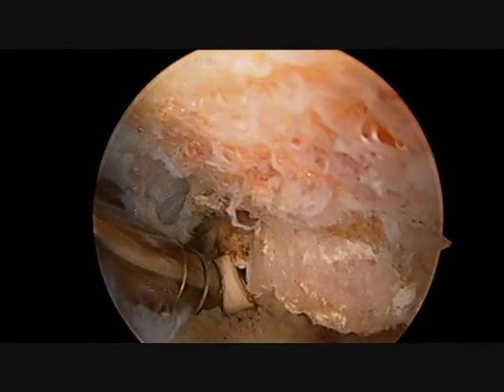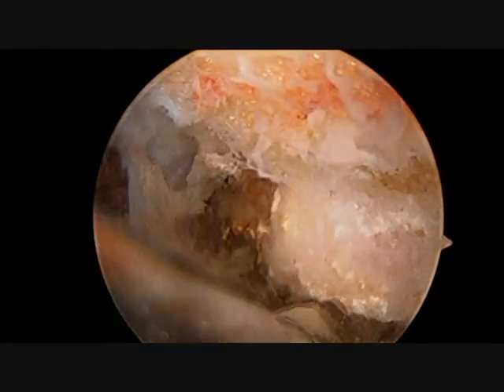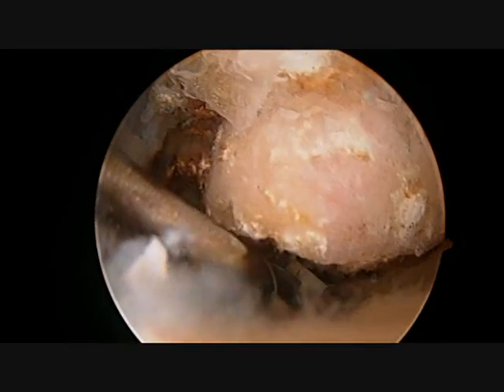In this initial view you can clearly see the end of the clavicle, which has no visible cartilage and shows exposed bone and a large spur on the lower side.